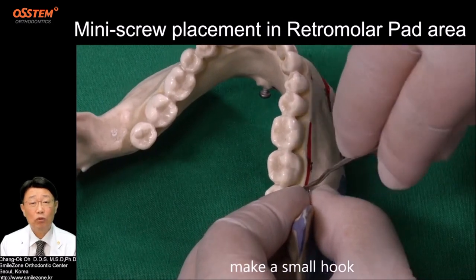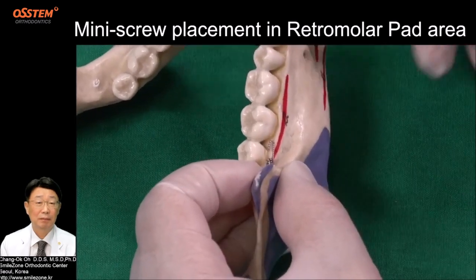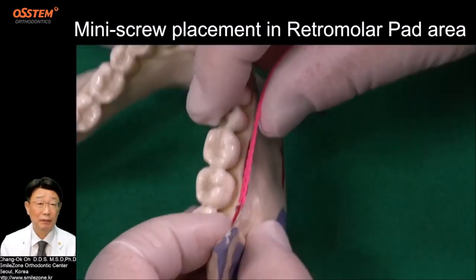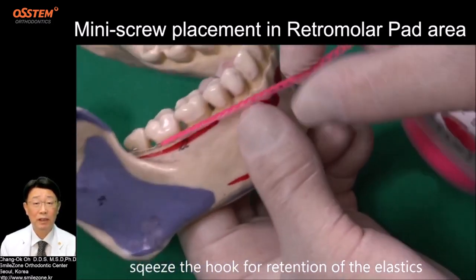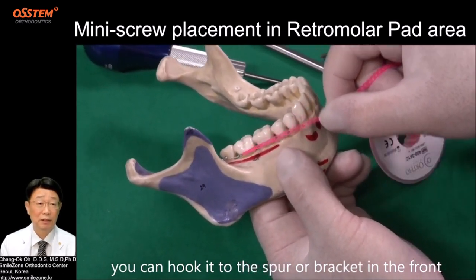Make a small hook, then you can hook elastics or coil spring, etc. Squeeze the hook for retention of the elastics. You can hook it to the spur or bracket in the front.